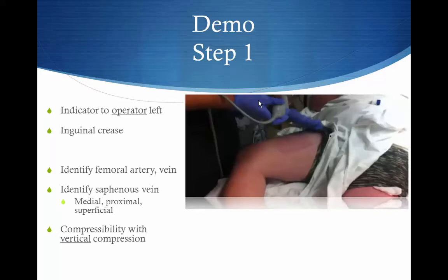And then really you're just checking, is that vein compressible? Yes or no? That's the key question that you want to ask. And very important that when you compress this vein, you're pushing straight up and down on it. You don't want to be pushing at funny angles, because then you'll be pushing at a different plane than you're actually looking at on your screen. So let's watch a quick little demo of this dude here, who I think probably it's his first time ever doing an ultrasound, but see if he knows what he's doing.